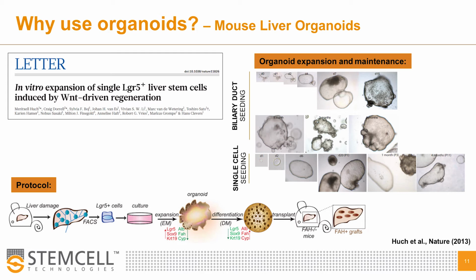The organoids consist of a spherical monolayer epithelium, and the organoids can also be passaged long-term. This characteristic represents a huge advantage compared to other in vitro experiments that are based, for example, on primary hepatocytes, since organoids allow for continuous supply of hepatic cells without needing to go back to an animal for tissue.